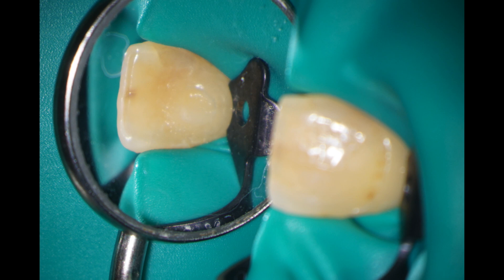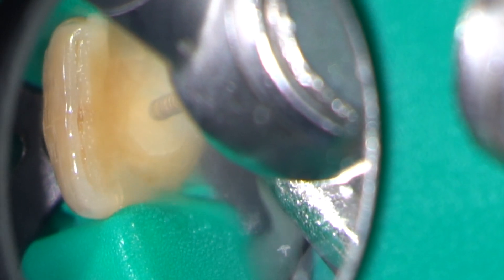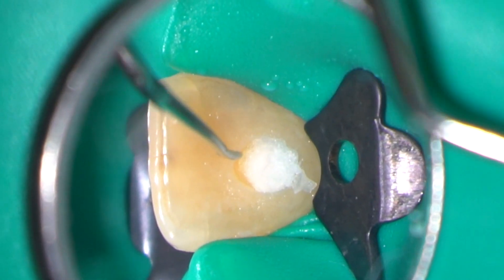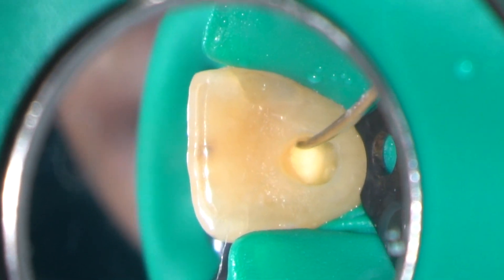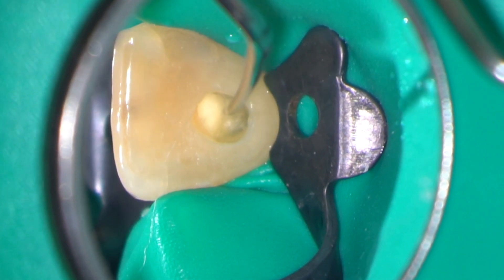Here you can see that I've isolated the tooth with rubber dam and I'm now going to remove the filling that's in the access cavity with a long tapered diamond. You can see that the access cavity is nice and small and conservative, but it's probably placed a little too far down the cingulum — ideally you want to extend towards the incisal edge to give you that straight-line access. In this case the practitioner was heading buccally and if they'd continued they would have perforated the buccal wall.